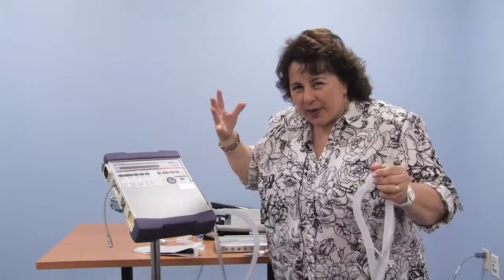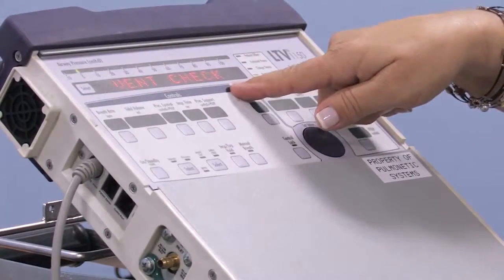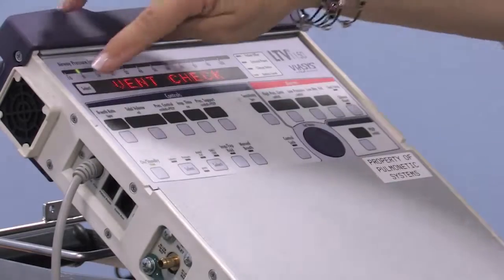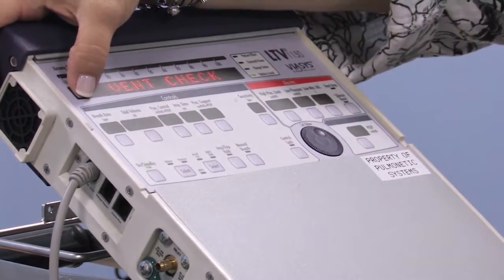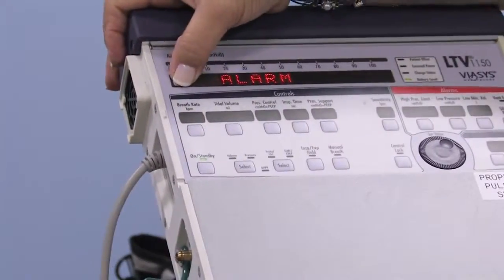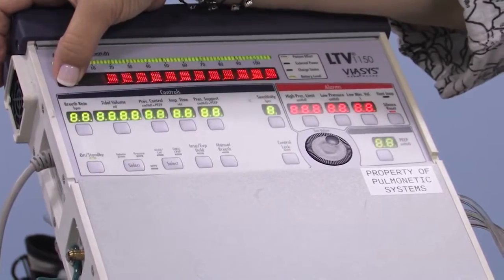What do you do when you hear a noise? You silence it. We're now in the vent check mode. We're going to use the set value knob and the select button to go through a certain series of ventilator pre-use tests. If we want to, we can check the alarm. Now I can't silence it now because I'm testing it. I can't silence it. The next one is the display.